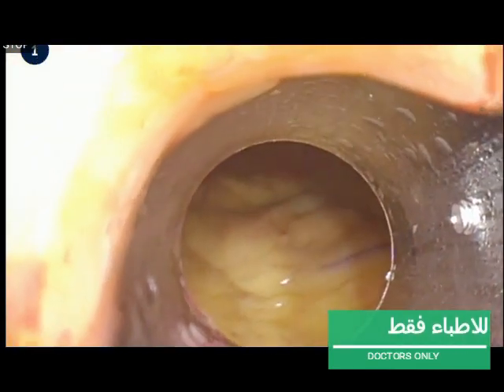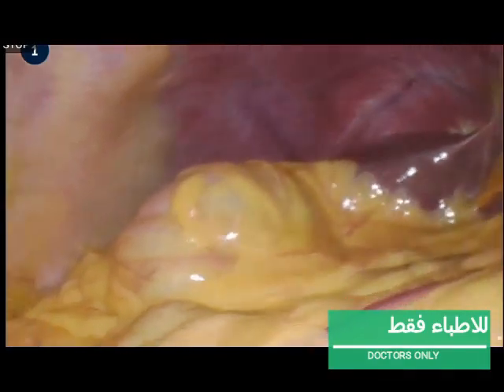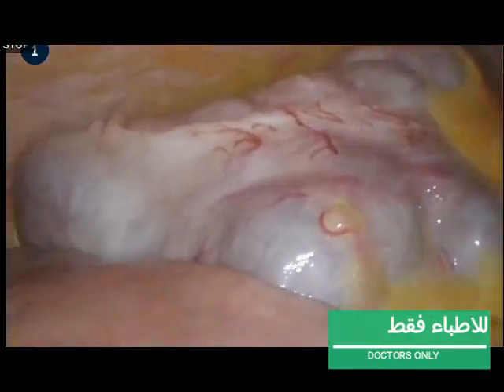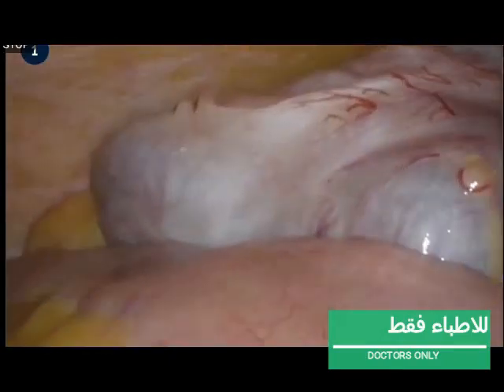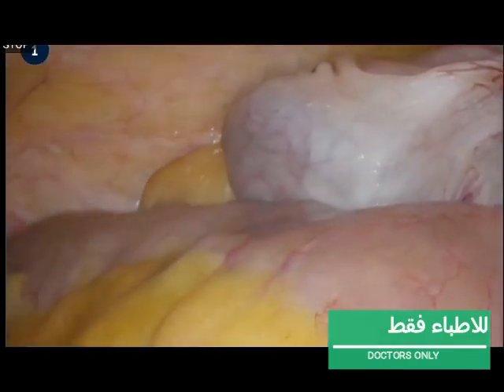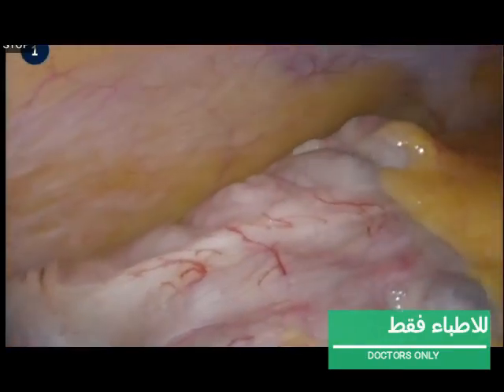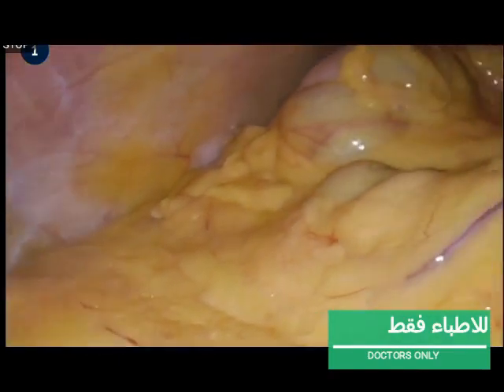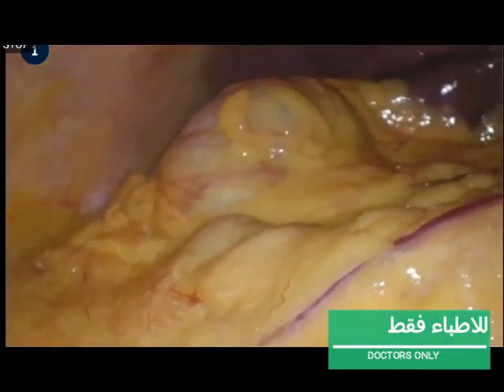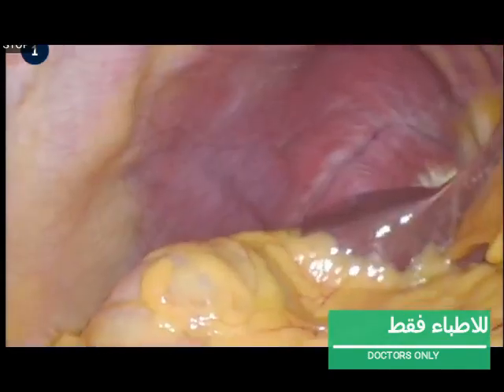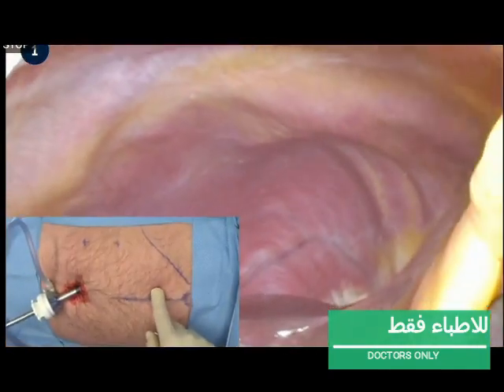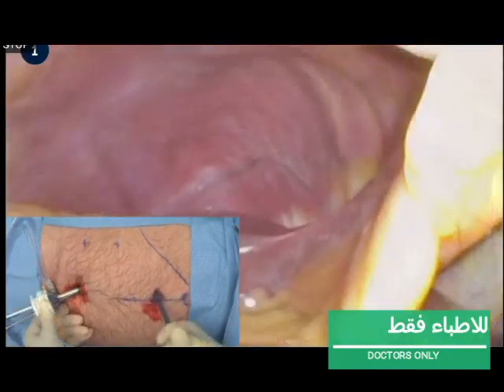A laparoscopic camera is inserted through the sub-umbilical trocar. With this camera, the peritoneal space is inspected, with special attention being paid to adhesions and inflammation of the gallbladder. Under the camera's guidance, a second trocar is inserted a few centimetres caudal from the xiphoid process.